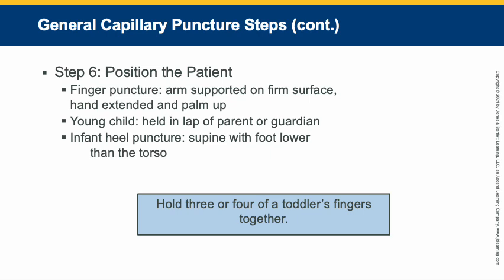Coordinate any needed changes to a bassinet, incubator, or phototherapy lights for infants in the neonatal intensive care unit or the nursery. Make sure you ask the baby's nurse so everything is returned back to the way it was prior to specimen collection. When performing a heel puncture on an outpatient infant, some phlebotomists let a willing parent hold the child during the procedure.